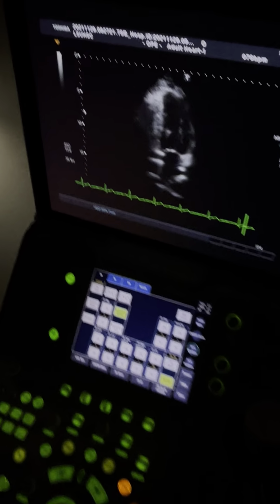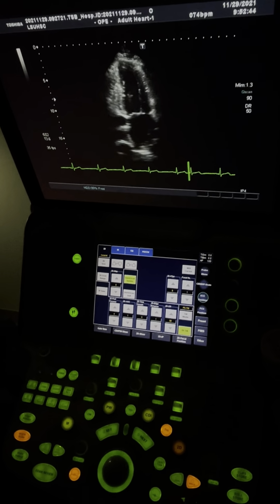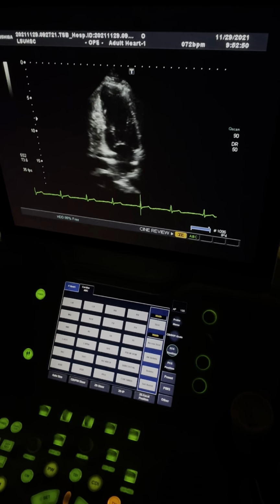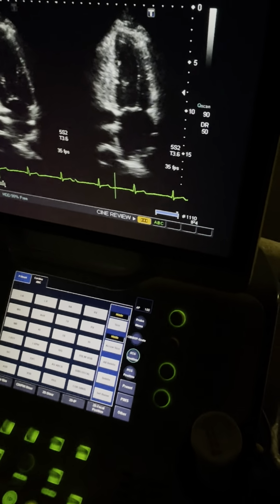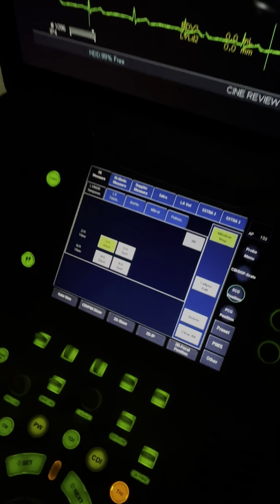And then take a little breath in for me, Paul. Stop breathing right there. Hold it, hold it, hold it, breathe. So now I'm going to go through the same motions. Dual, diastole on the left, systole on the right. Calc, LV Simpson's 2-chamber diastole.